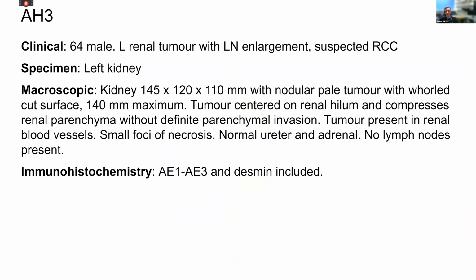Are you happy with that? And then there was one other comment about someone who has seen a similar case in the department. You do see similar morphology in clear cell adenocarcinoma, and I've seen a few cases in the bladder, so we cannot differentiate without more markers. That's fair enough. I think it would have been a difficult one to score had we not had that problem. So yeah.